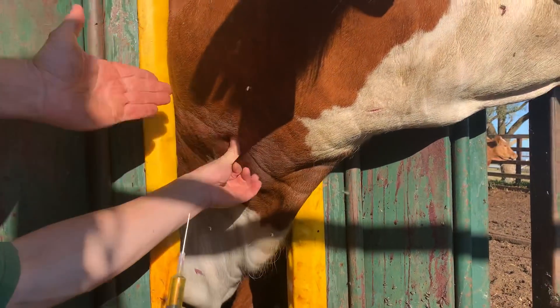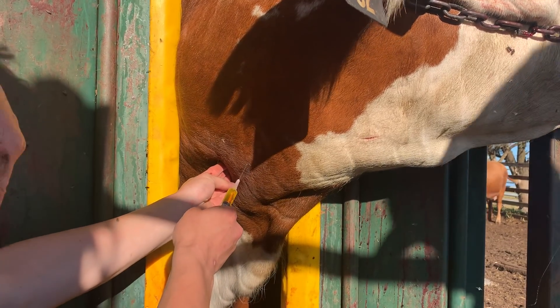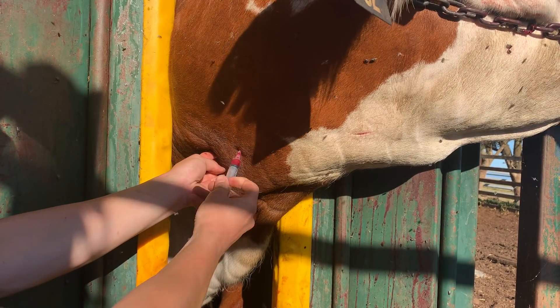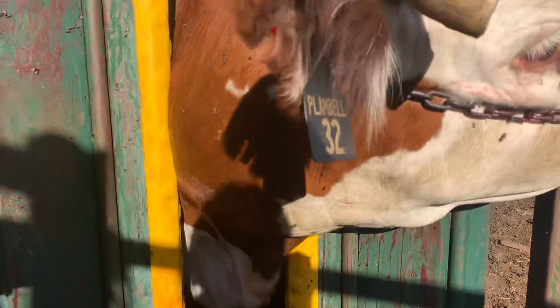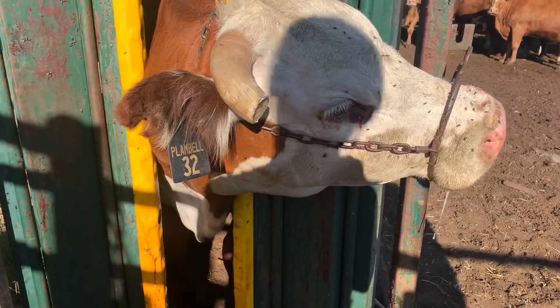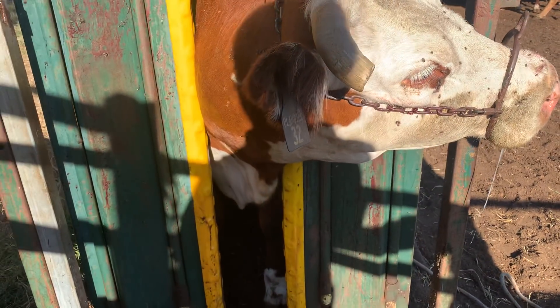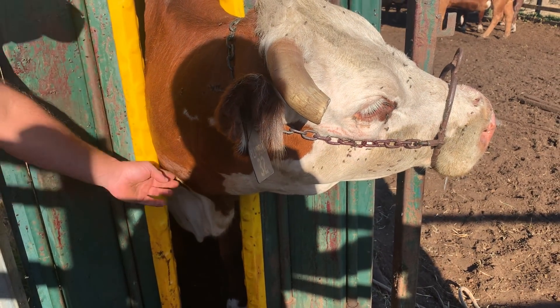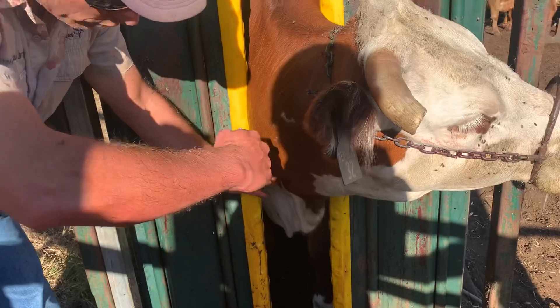I use, like, the karate — because then sometimes I put that against my knee to give me a bit bigger. I missed it there. What you've done there is that jugular's about that big — you've popped all the way through. Which could go in the carotid. If you go in the carotid, they go and then they fall over. So hop in. Don't go quite so deep, but come back and if you want it, you can throw it down the vein.